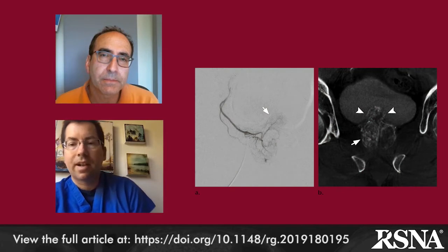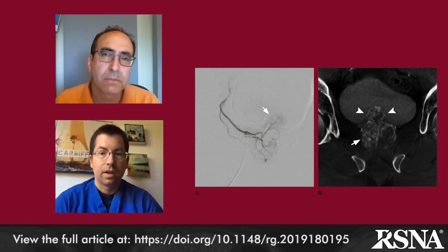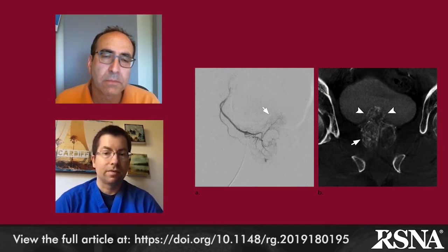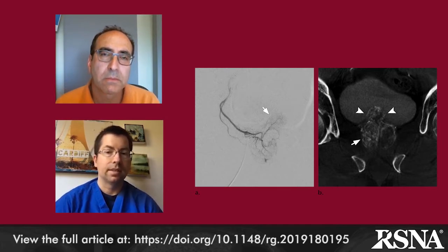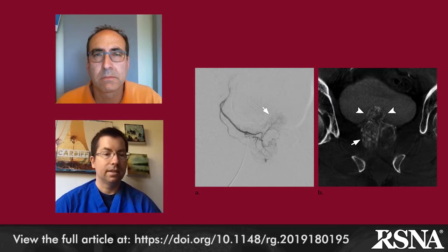Yes, the PErFecTED technique was pioneered by Dr. Carnevale in Brazil. It stands for proximal embolization first, then embolize distally. In this technique, the microcatheter is positioned in a safe area to treat, typically in the mid-prostatic artery, and a slow embolization is performed with dilute small particles.